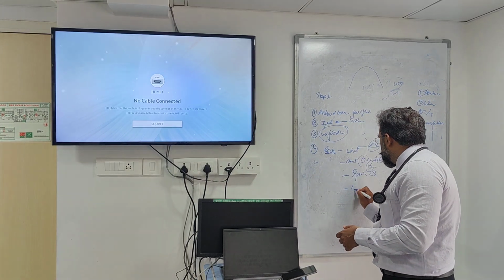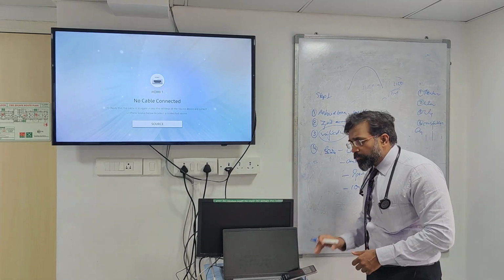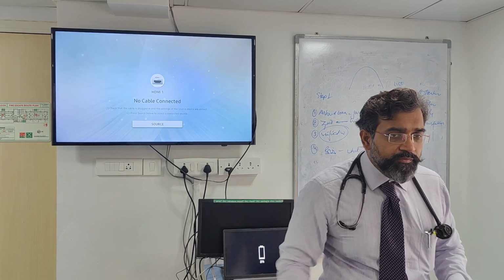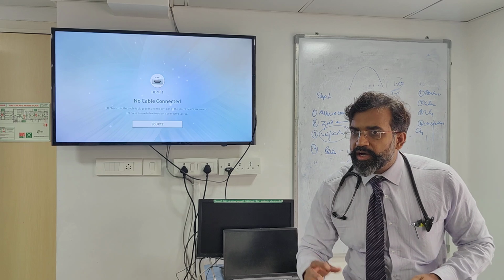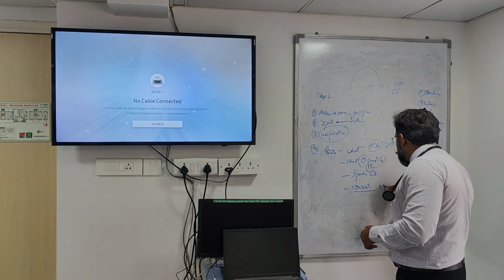Now, consistency. You have to inject it without a stop. Okay. If they inject it, give it, and then one more injection, give it one more injection, again the trace will not come. So, consistent speed.